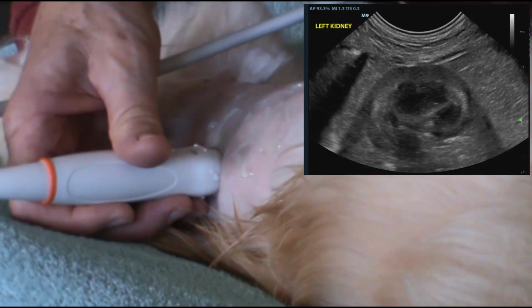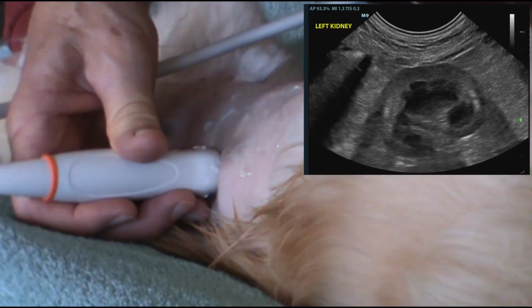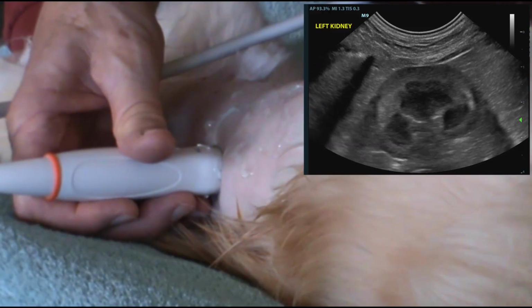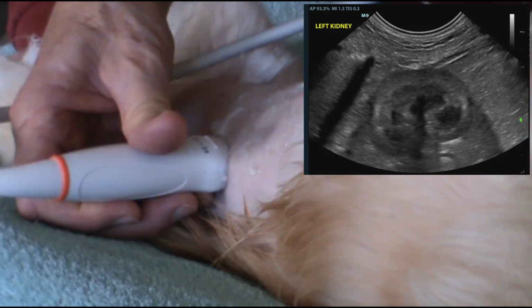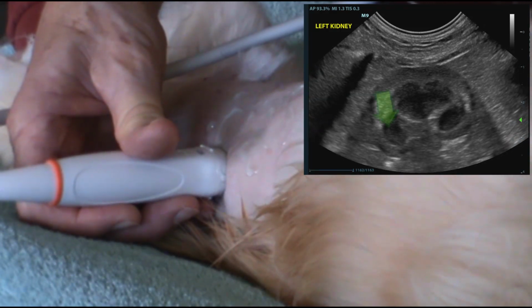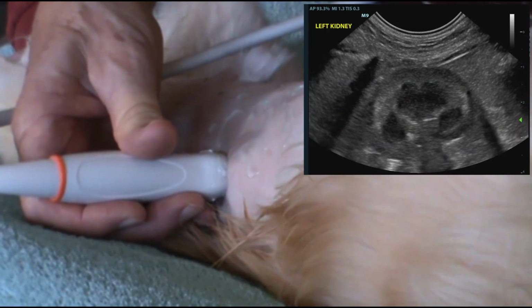If the transducer is rotated counterclockwise from a sagittal position, the medulla at the cranial pole is cut off. If the transducer is rotated clockwise from a sagittal position, the medulla at the caudal pole is cut off. So the desired image of the left kidney from a left lateral sagittal position will show medulla at the cranial pole, medulla at the center, and medulla at the caudal pole. The ultrasound image will tell you if the transducer is in the proper position.